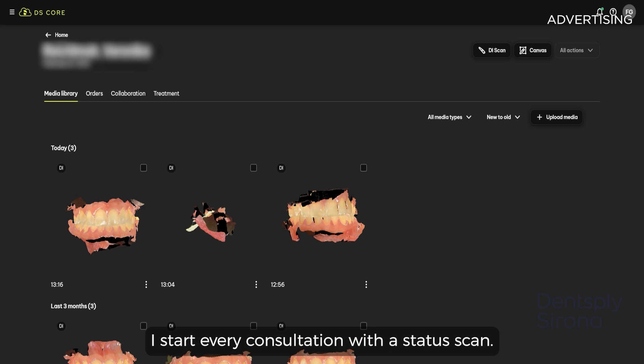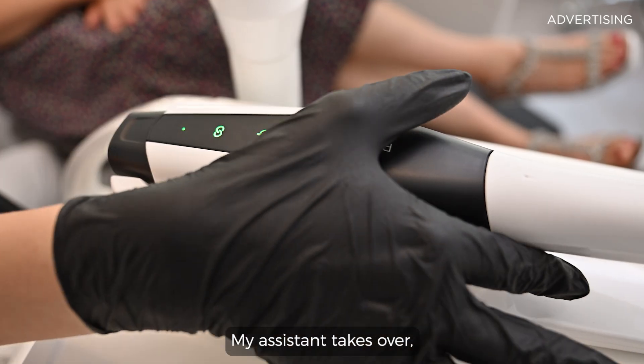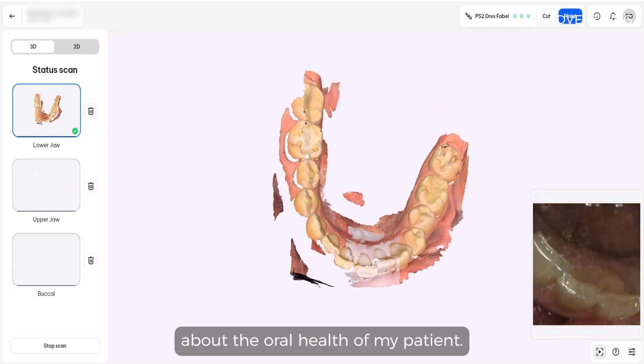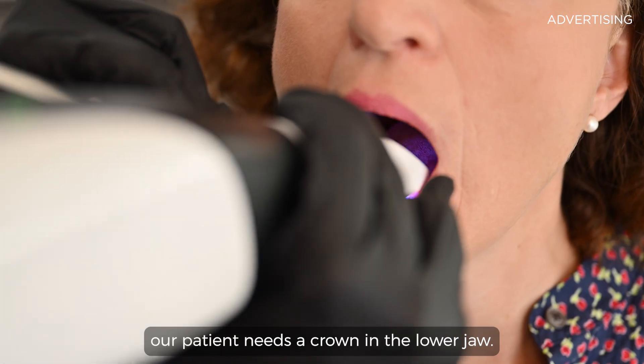I start every consultation with a status scan. My assistant takes over, takes the scan, and I have an overview about the oral health of my patient. In this case, our patient needs a crown in the lower jaw.